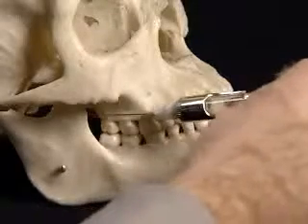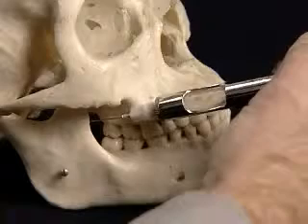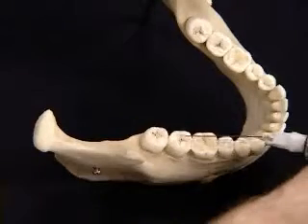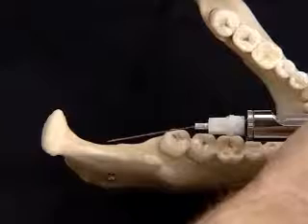The correct angle is assessed by making it parallel to the occlusal plane, and then the needle is advanced posteriorly parallel to the occlusal plane until you've advanced 25 millimeters. The needle should be advanced straight back, taking advantage of the arc of the needle and advancing it slightly posteriorly without actually touching bone.